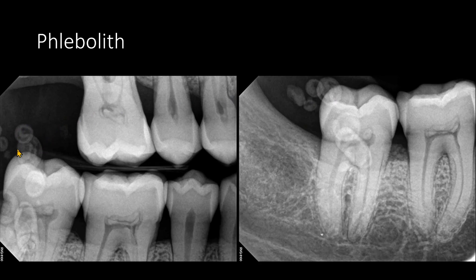These radiopacities are not osteoma cutis — these are phleboliths, calcifications in old thrombus or veins. These have the shape of a bull's eye, and this is probably a good example: an outer radiopaque ring with a central core of radiopacity. It should not be difficult to differentiate an osteoma cutis from a phlebolith, both radiographically as well as clinically.